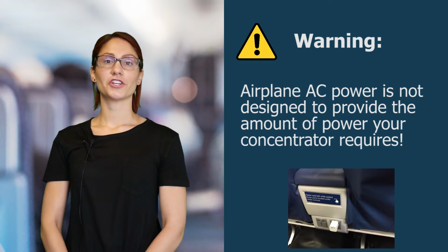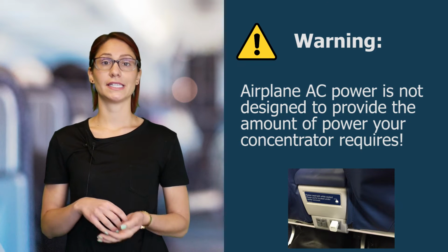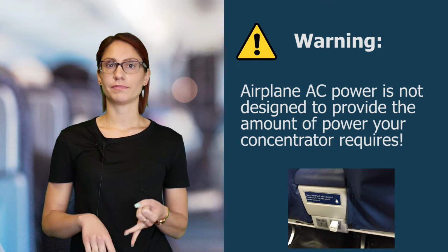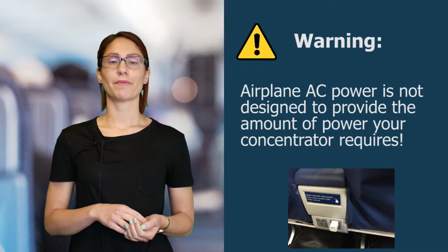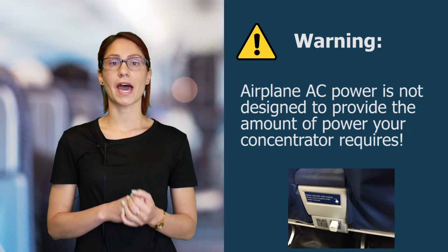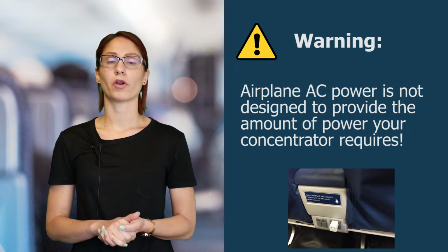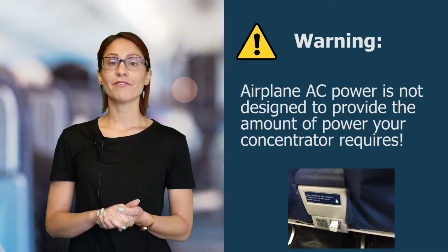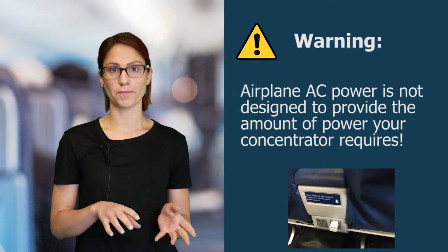We do also have to warn you about onboard AC power. A lot of airlines and planes these days have an AC outlet where you can plug in your phone or your laptop or whatever else you brought. These are generally not designed to power your portable oxygen concentrator. So we recommend you still bring the batteries that you need to cover the FAA's regulation to be flying with your portable oxygen concentrator. And most airlines still require you to have the right amount of battery life, even if they have an AC outlet available.